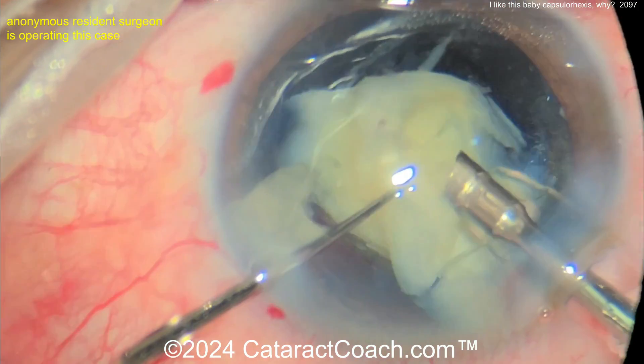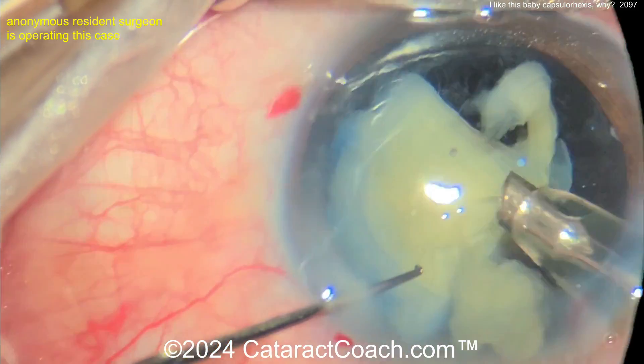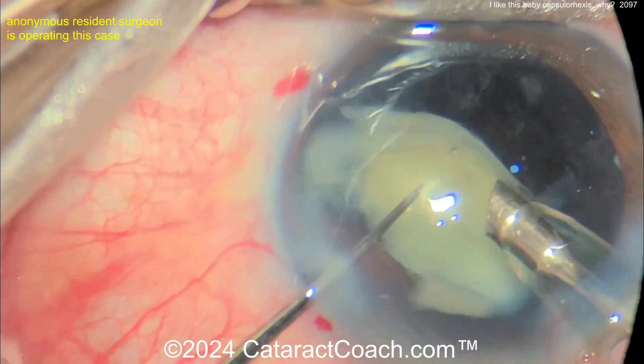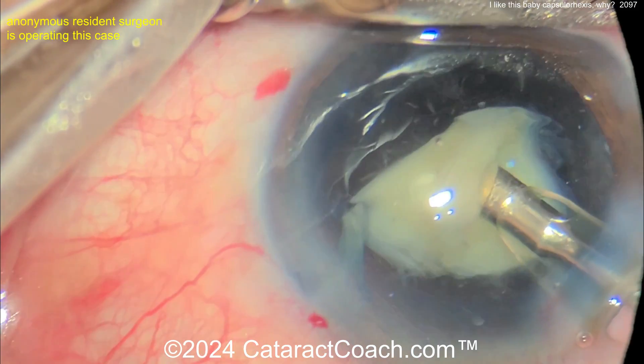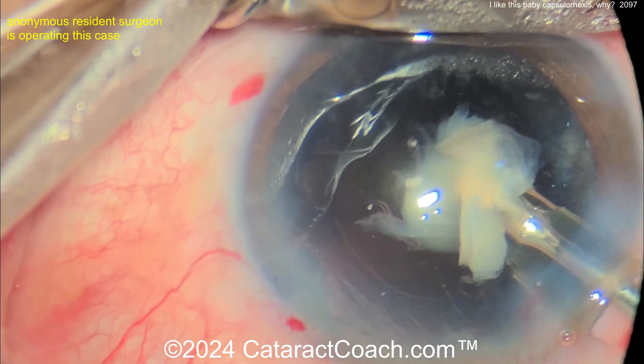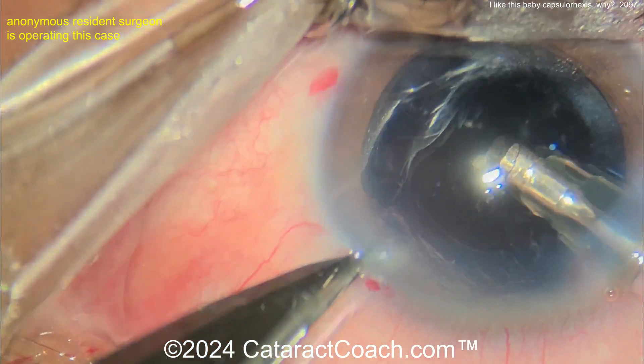Here's the rest of the nucleus coming through — buzz buzz with the phaco probe. Get those pieces in front of the phaco tip. Good job here. Maybe this wasn't a resident — this video was sent to me with no name attached, so I assumed it was an anonymous resident. Taking this piece down, now making the incision a little bit larger.